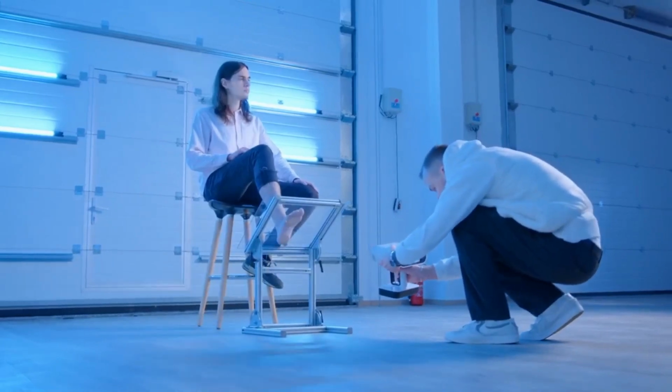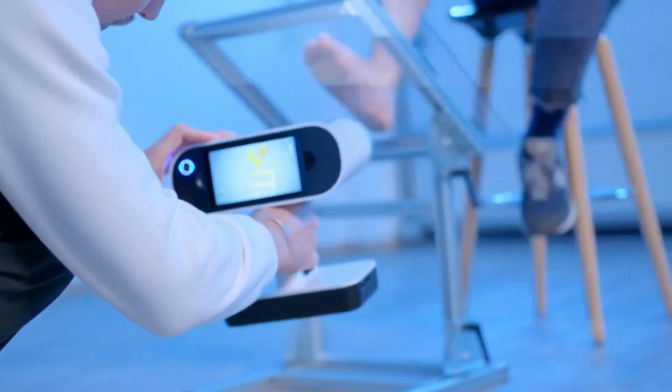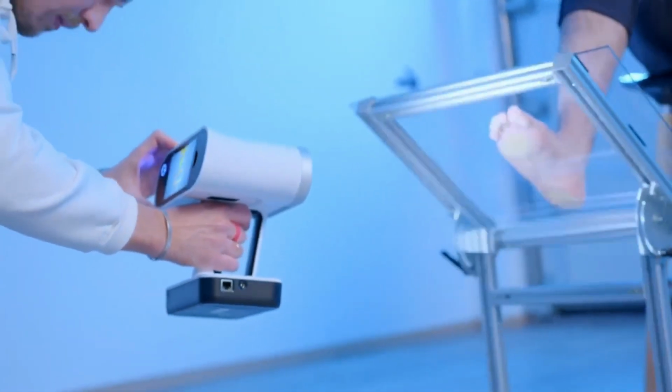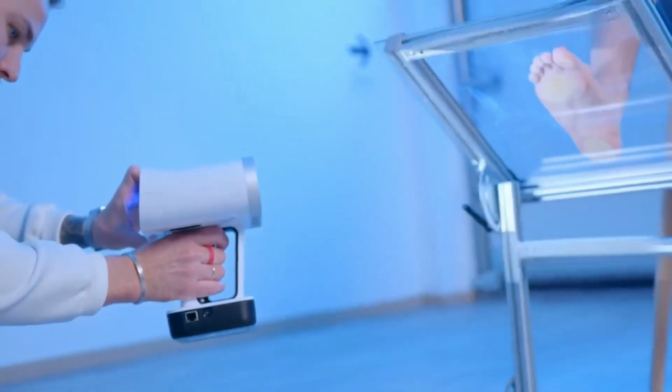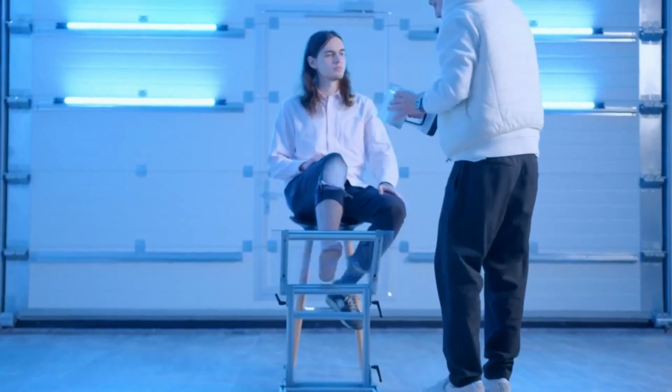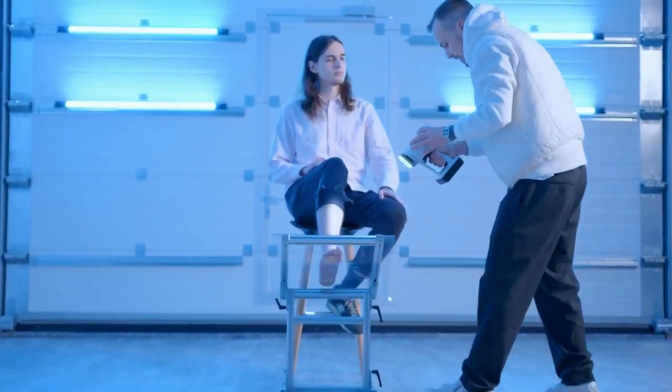In fact, that's where we start. We scan the sole of the foot, changing the angle in such a way so we can see first the left and then the right parts of the sole. And then we move Leo to capture the heel. And then we rise up to the upper part of the foot to scan the toes. Actually, the frame of the table will help us here.